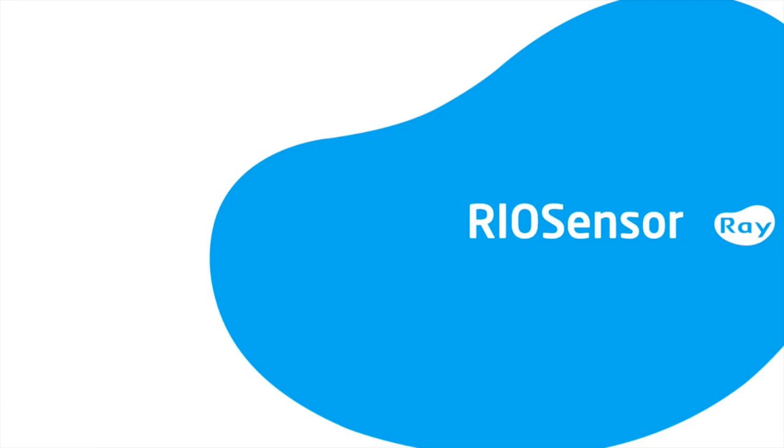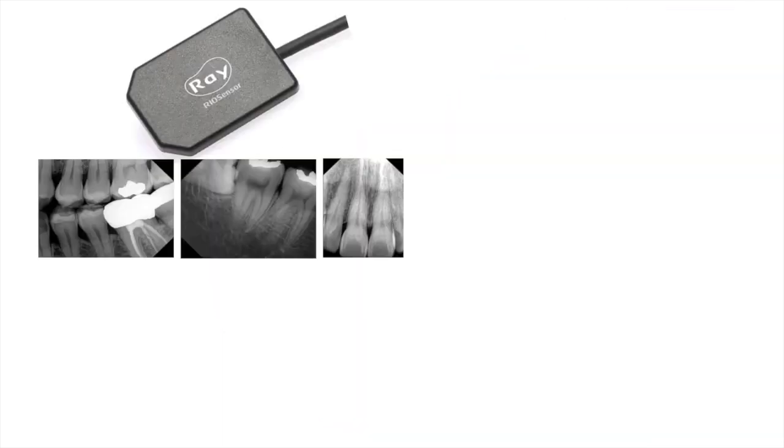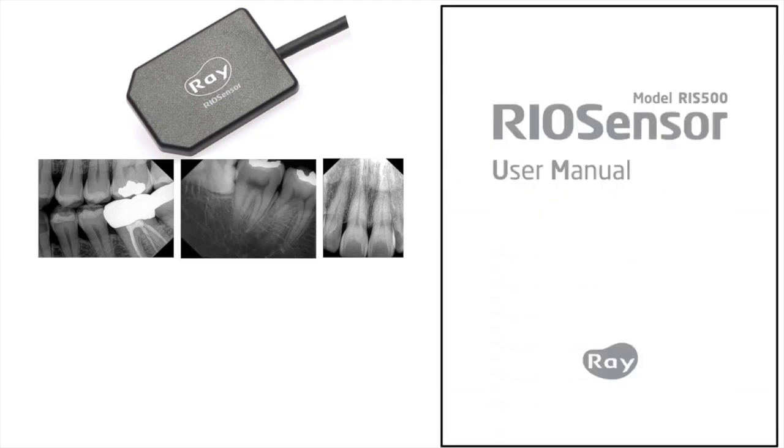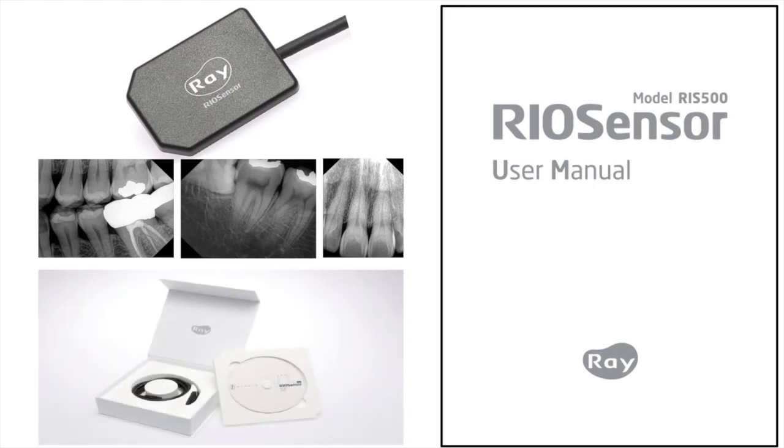Welcome to the RIO sensor training video, and thank you for choosing RIO sensor as your dental x-ray sensor solution. The purpose of this video is to learn about the basic fundamentals of the sensor and RIO view imaging software. The proper techniques that will ensure the safe usage of your RIO sensor. We recommend that you study the manual in its entirety before operating your RIO sensor. You can access the manual in the CD comes with the package. As the operator, it is your responsibility to ensure the proper and safe use of the RIO sensor.